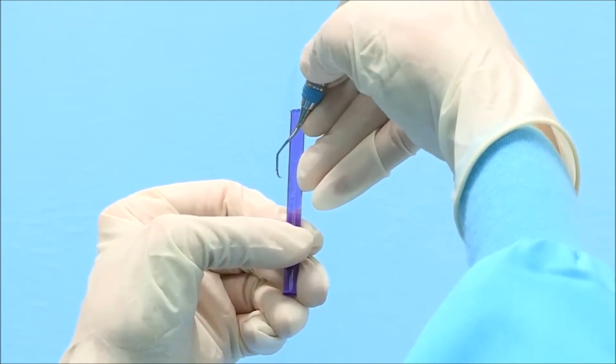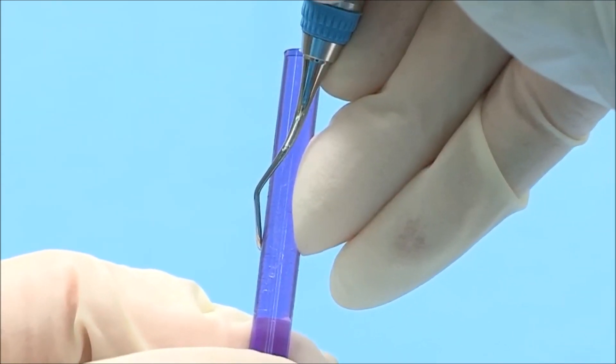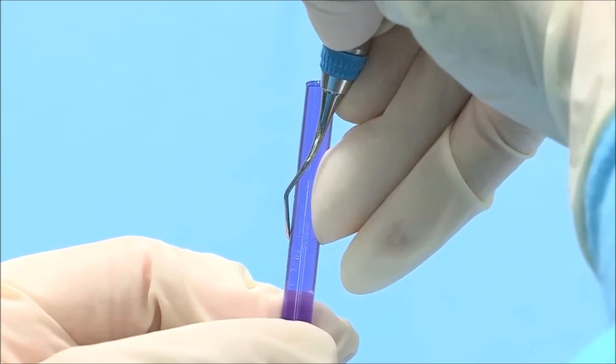Place the cutting edge against the left side of the stick. Place your ring finger against the side of the test stick opposite the cutting edge to act as a fulcrum while testing. Press the cutting edge into the test stick and release.